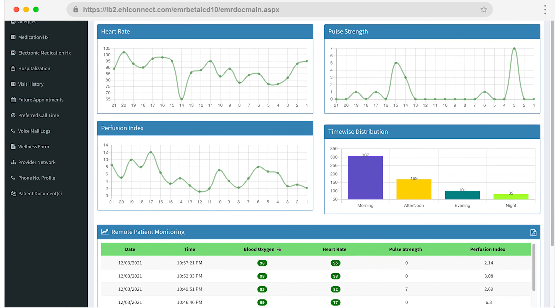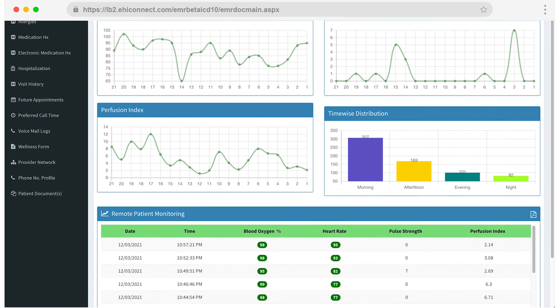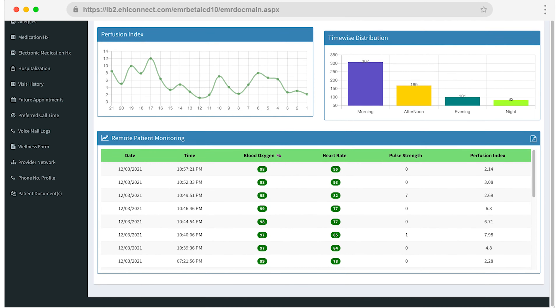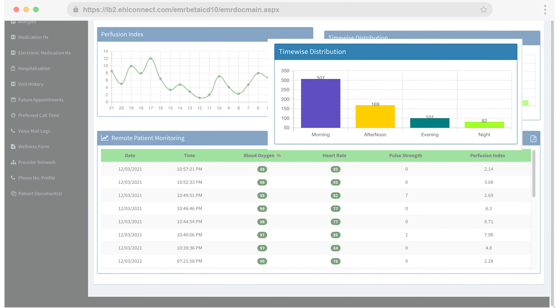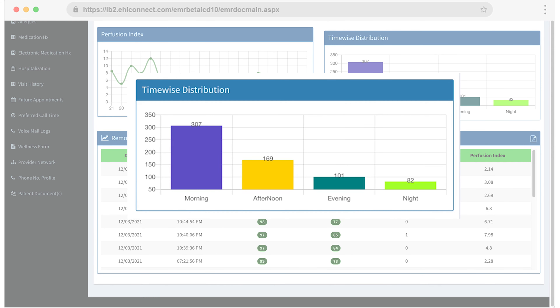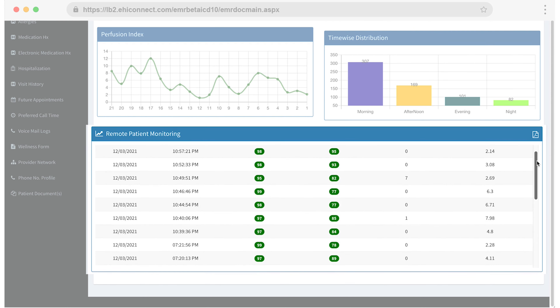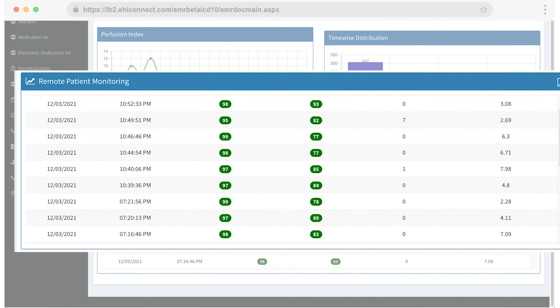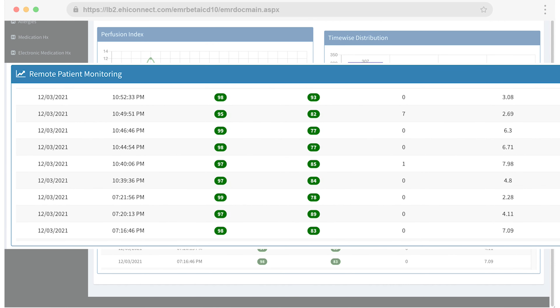You'll also see an overview of your patient's normal versus abnormal readings. You can see what time of day they're taking readings, and you can view a detailed breakdown of every reading's measurements.